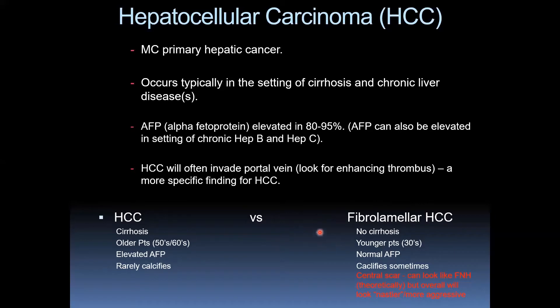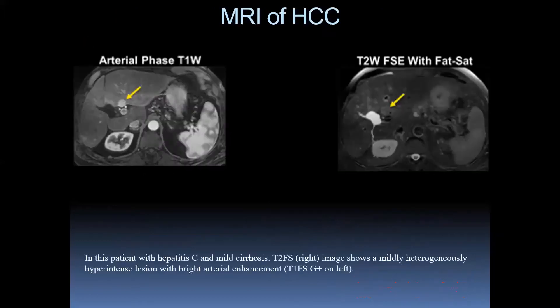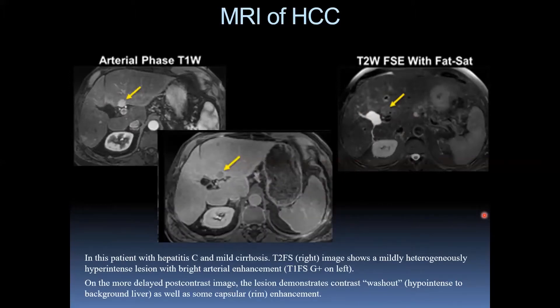HCC's cousin — fibrolamellar HCC — typically occurs in younger patients, no cirrhosis, normal alpha-fetoprotein levels, can see calcifications and a central scar. Theoretically, fibrolamellar HCC can look like focal nodular hyperplasia but will have a more aggressive appearance. Here is an MRI of hepatocellular carcinoma in a patient with hepatitis C and mild cirrhosis: a mildly heterogeneously hyperintense lesion on T2 with bright arterial enhancement. On the more delayed post-contrast image, the lesion demonstrates contrast washout, becoming hypointense to the background liver, with capsular rim enhancement.